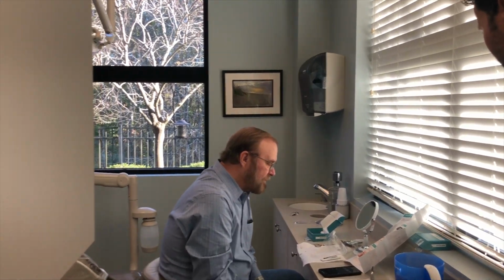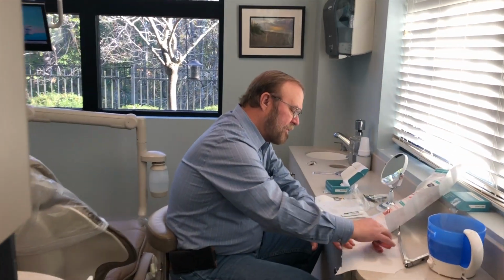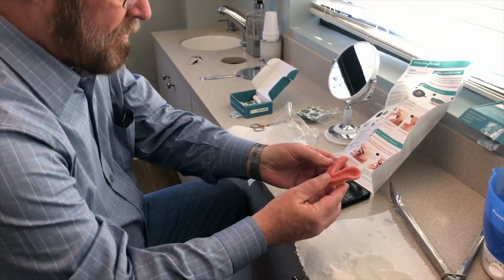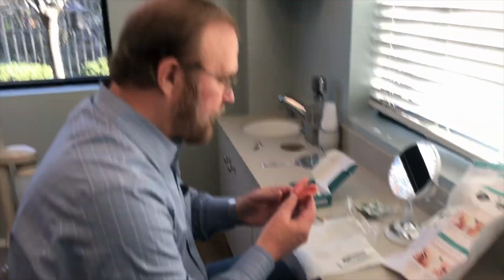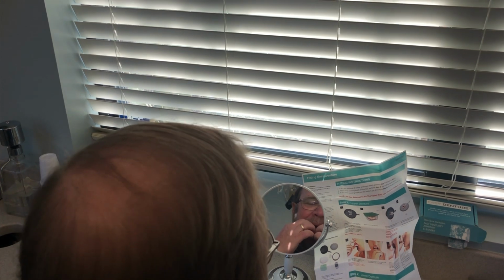Right about now, you can start playing with it, shaping and adjusting. Since you have the upper fitted already, the best is just to line up the bite first and get it in there, close down on it a little bit, and then extend the bottom. You could reach around and just squeeze around your ridge. You're not feeling anything sharp on this one, right? Okay.